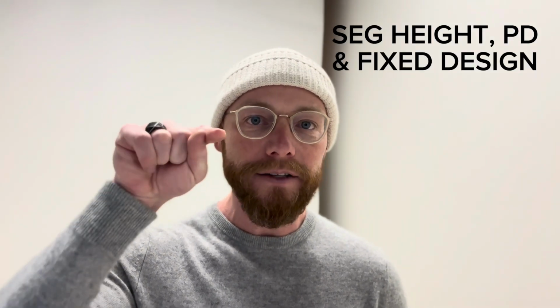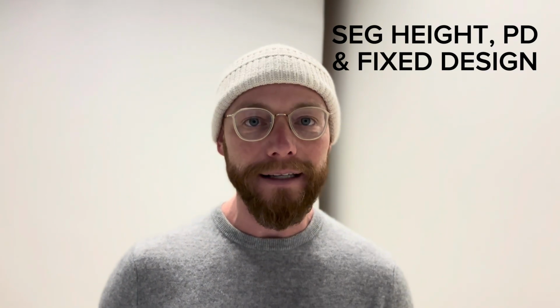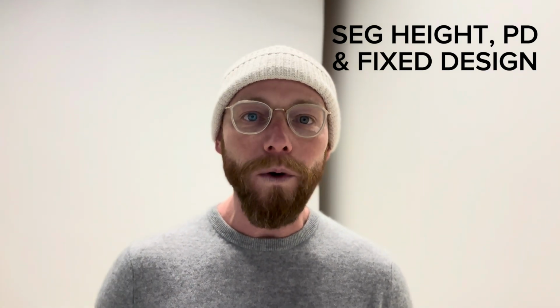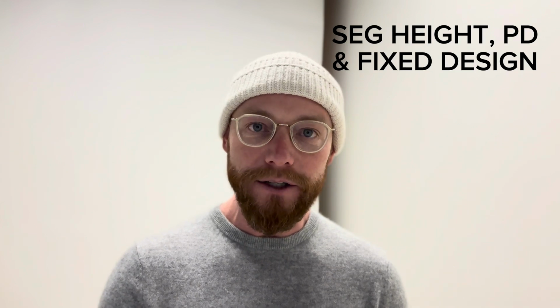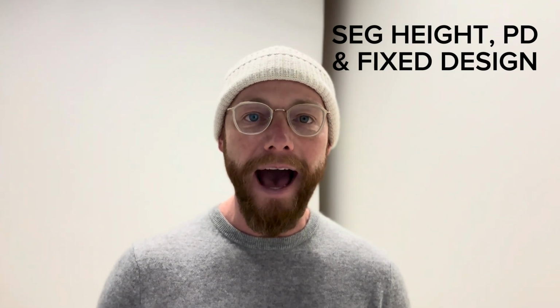But if that is right, we want to get the seg height correct, so exactly where your pupil sits in the lens. We want to get that PD correct, so you're getting maximum vision. And number three, what is that design, that fixed design? What is your choice? What is the optician's choice for you based on your use of that lens?